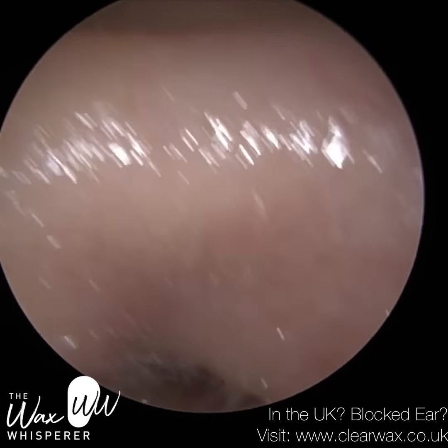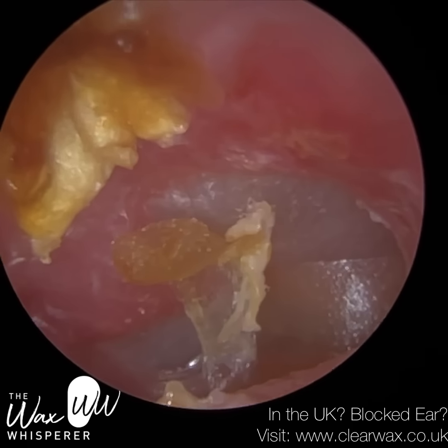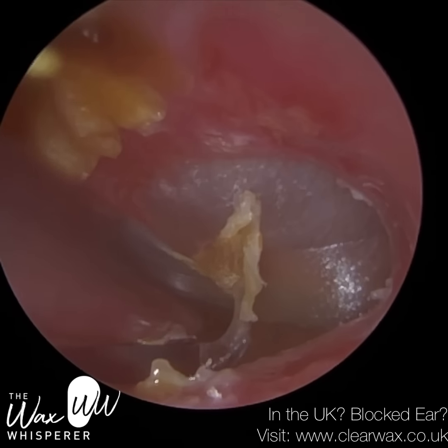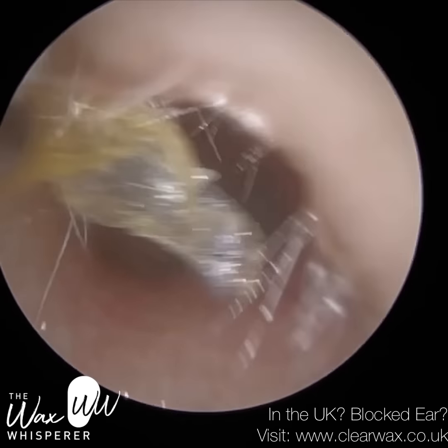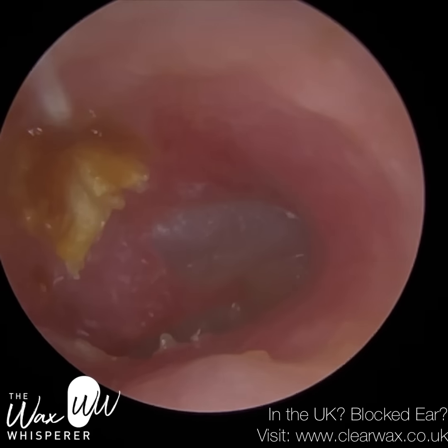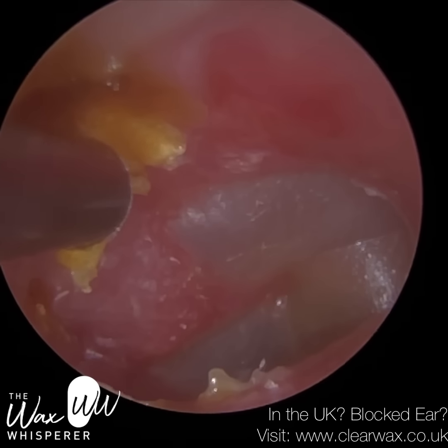And you can just see how red the medial canal wall is. That's where the plug was getting bigger and bigger and compressing against the canal wall. So that region is very tender. I just want to remove this next layer of skin. So this skin, if we left it there, I just don't think it's going to migrate in this patient. I think this patient's prone to developing Keratosis Obturans now. And this is the posterior superior quadrant of the canal wall.